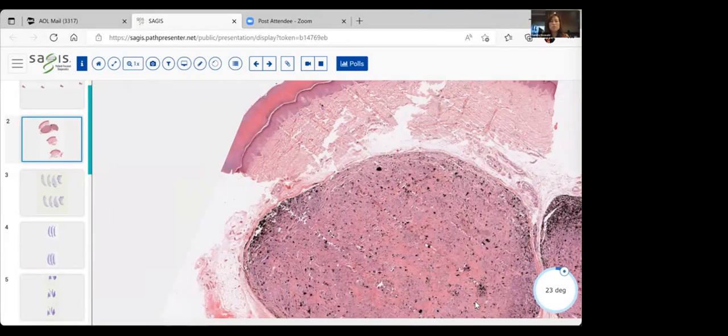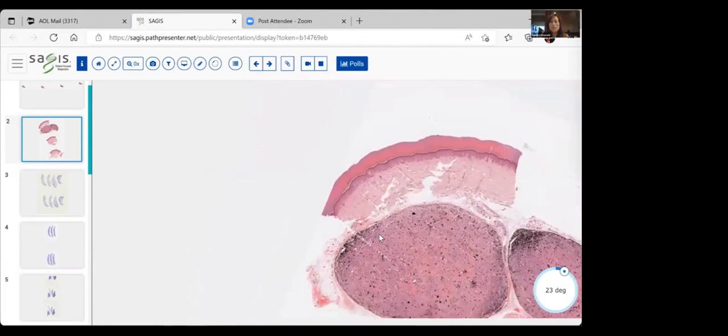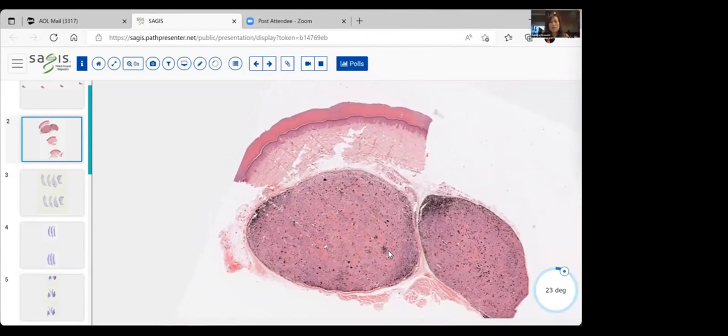But knife chatter is a very helpful clue to you in granulomatous dermatitis that there may be a foreign material in the tissue. So you would want to go ahead and polarize your material, particularly along the areas of chatter, to see if you find the material. Sometimes material isn't quite so obvious as in this case. So this is a wonderful example of a graphite tattoo in the body's histiocytes forming larger cells to try and engulf that and remove the material.